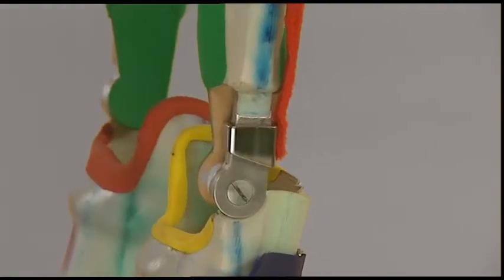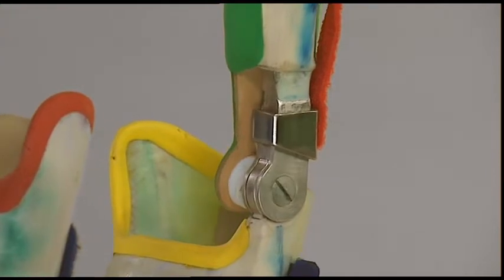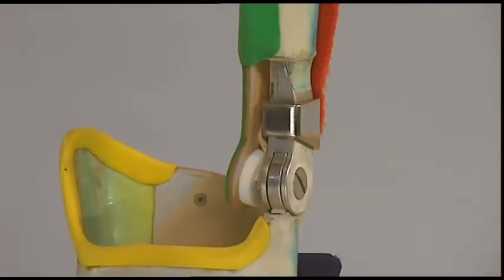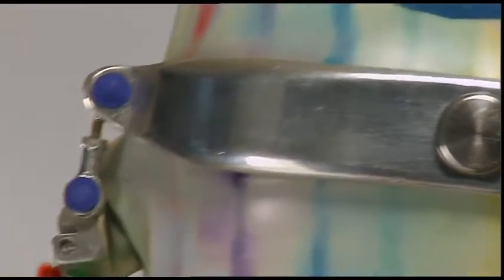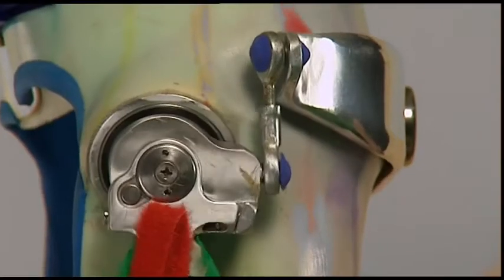The unilateral construction of the splints combines optimum functionality with high movement comfort. At the hip area, joints with two-dimensional movement are integrated. They allow a guided outward and inward rotation in regard to flexion and extension.